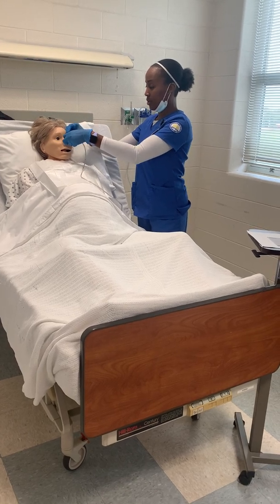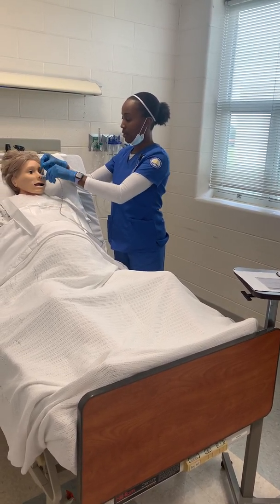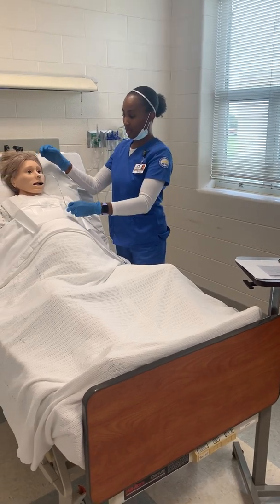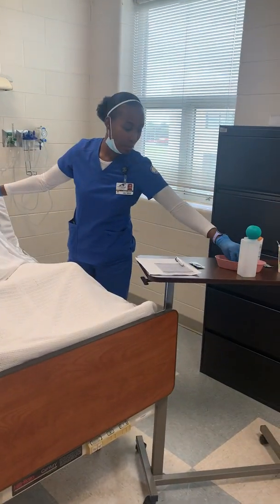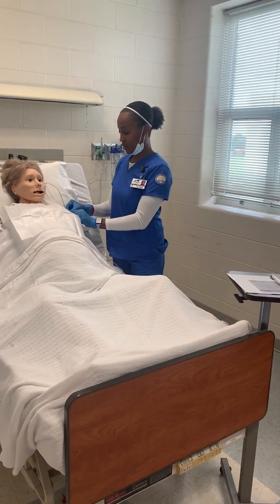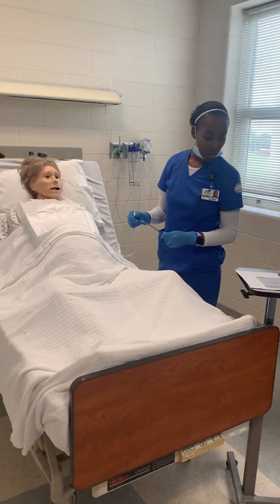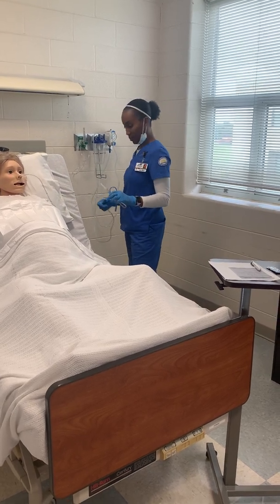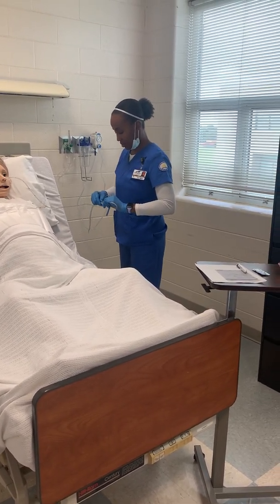I'll get my tape. And then I'm going to have her turn her head side to side. And then I'll get a safety pin and rubber band and secure it to the gown. And once it's all connected to her, I'm going to go ahead and connect it to low intermittent suctioning and turn it on.